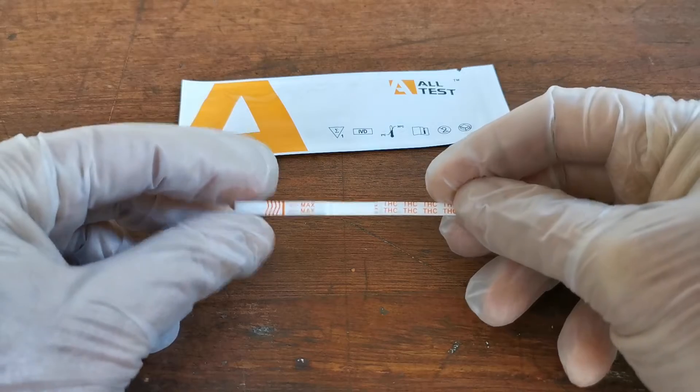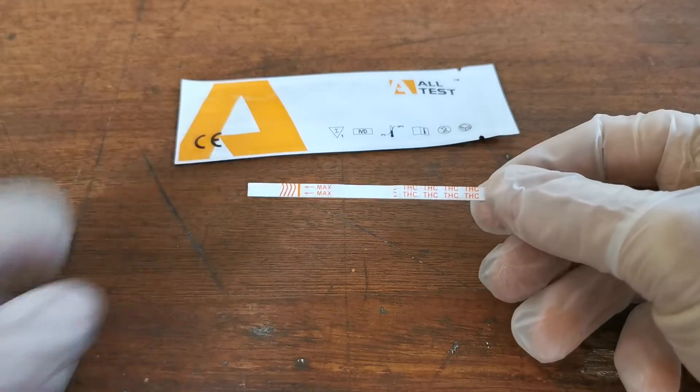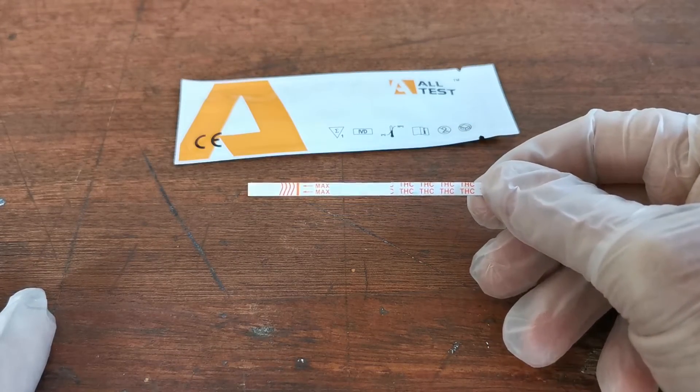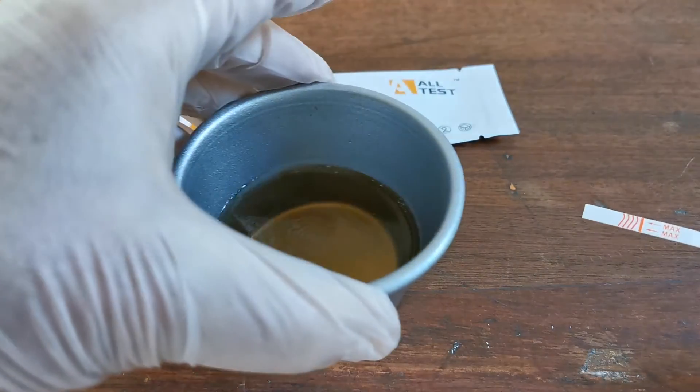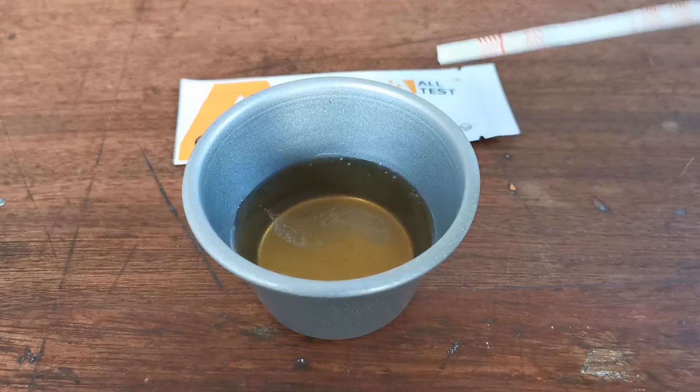Remove the test strip just before you're ready to perform the test, and do so on a fresh sample of urine that's been collected. We've got a synthetic urine here that we're going to use to demonstrate how to do that.